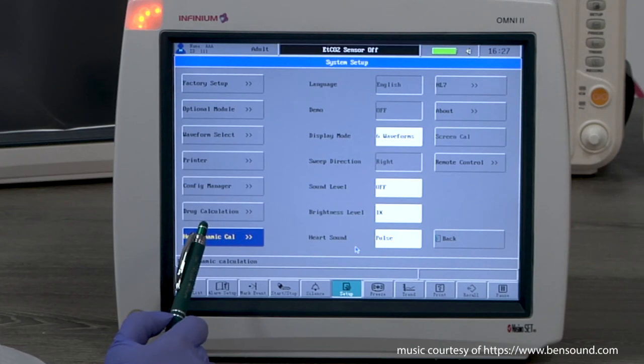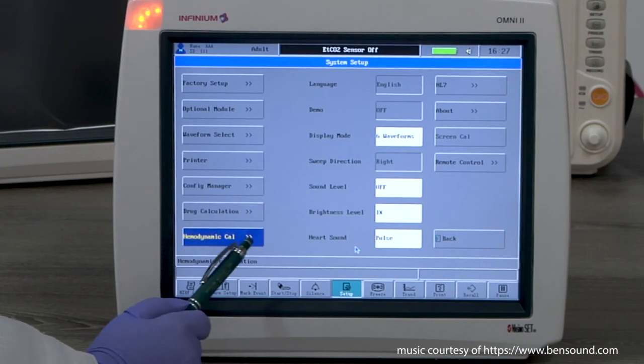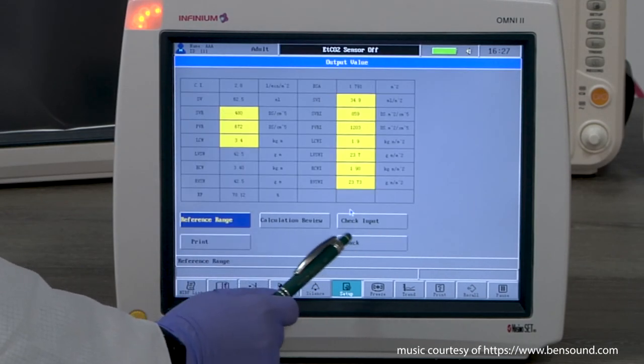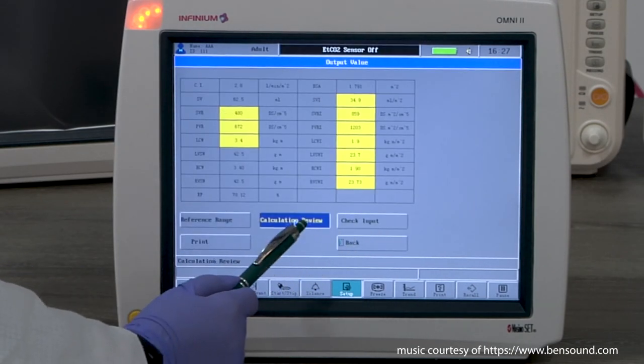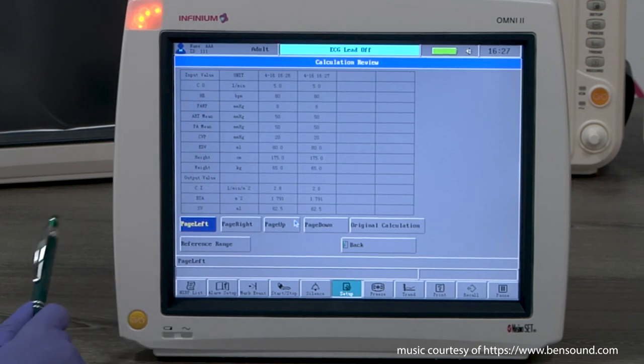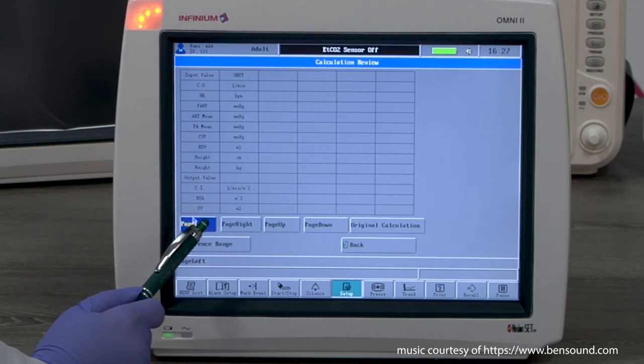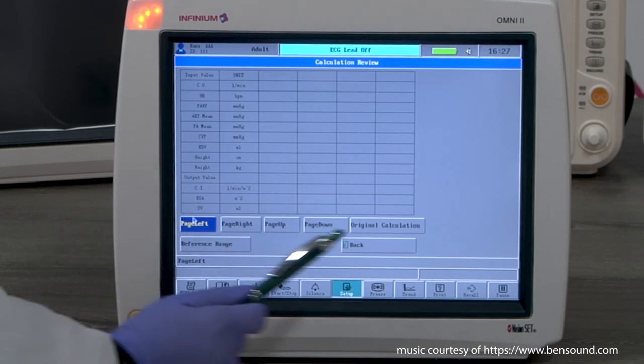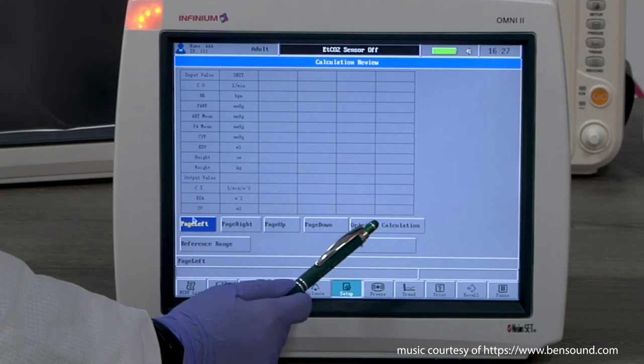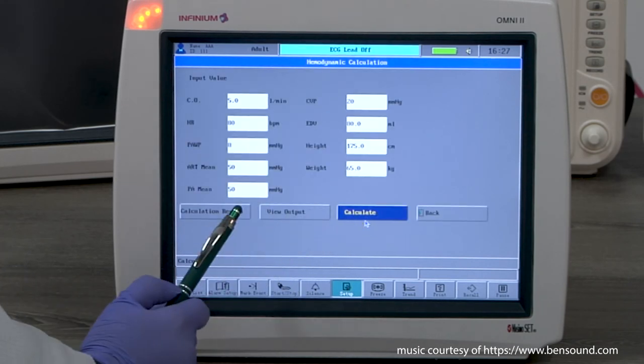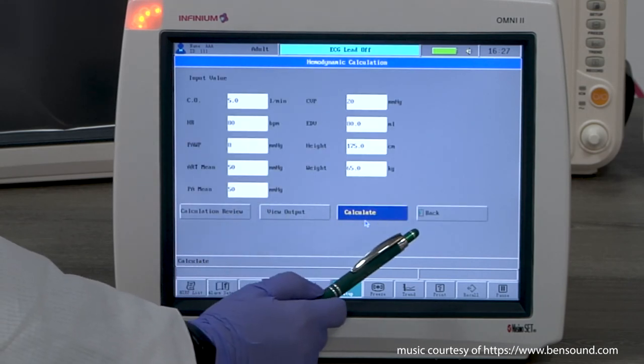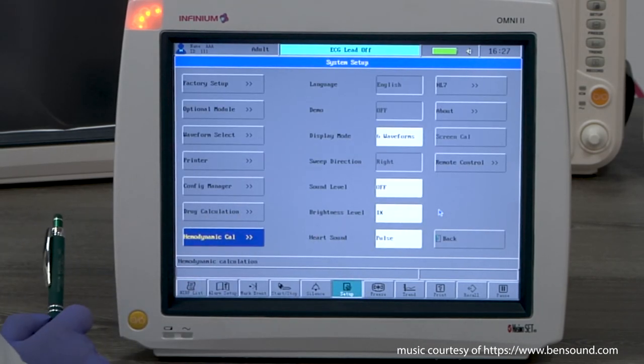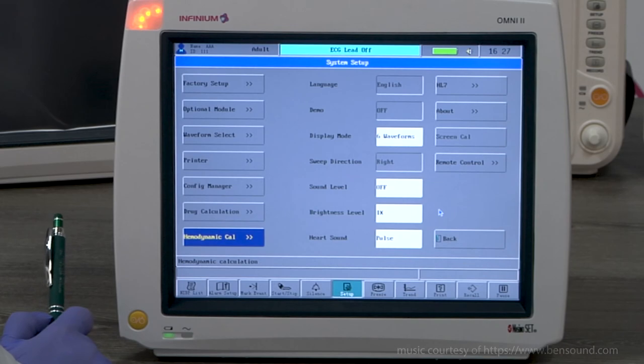If you have done multiple calculations, you can check Calculation Review to see the history. This table can keep up to 12 records. On this page, you can select Back to exit or select Original Input to check the input or start a new calculation.